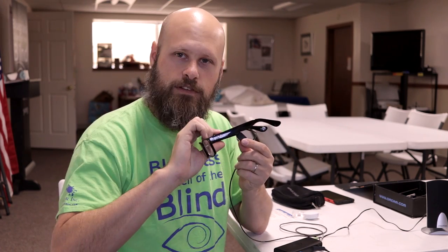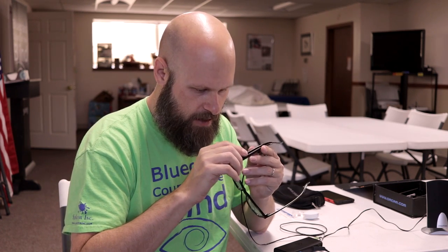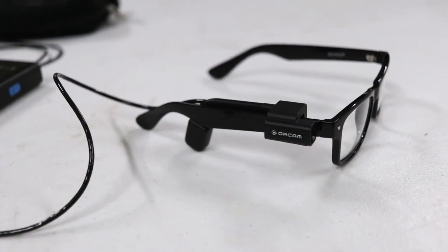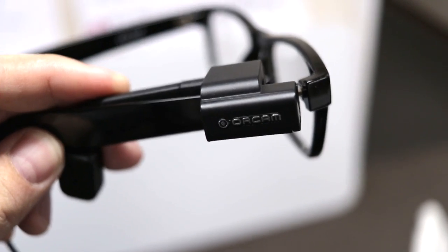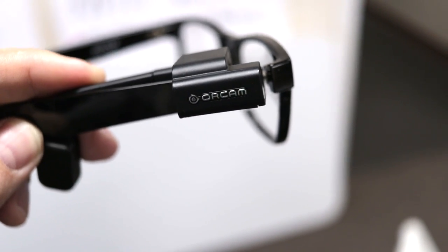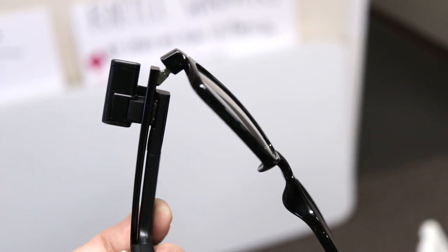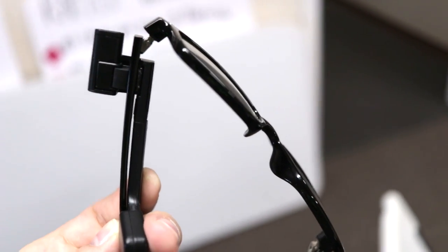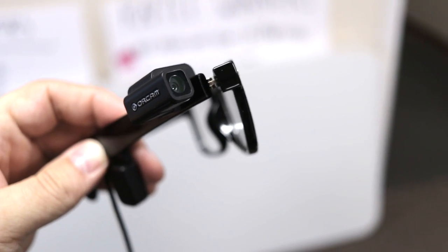There is a little speaker here that goes right next to your ear and allows you to hear the device. These glasses don't come with the device — this is just a pair we had to use for demonstration purposes. You get the device and these little spacers that will attach it to a pair of glasses, along with a little Allen wrench, and you crank this on. You attach the little spacer, and then the camera pops onto that spacer. It can be removed, but it's not the easiest thing in the world to do.